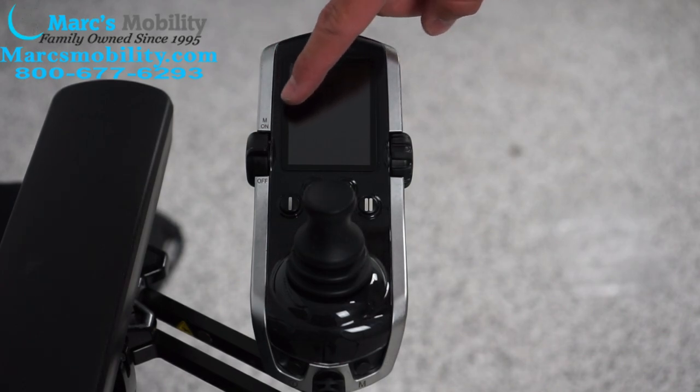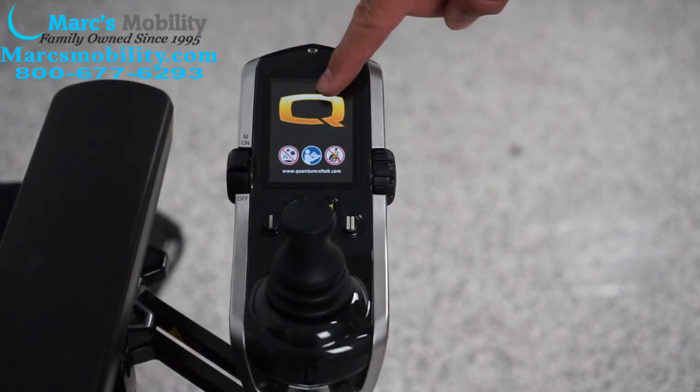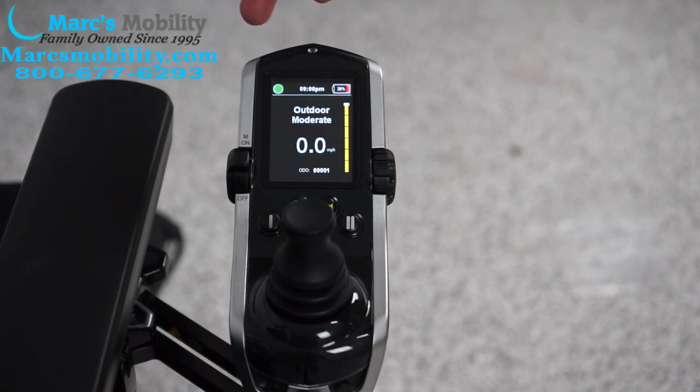To turn the power chair on, you have a lever on your left-hand side. You're going to push that lever forward. You will see a Q come on the screen and then you will see the display.